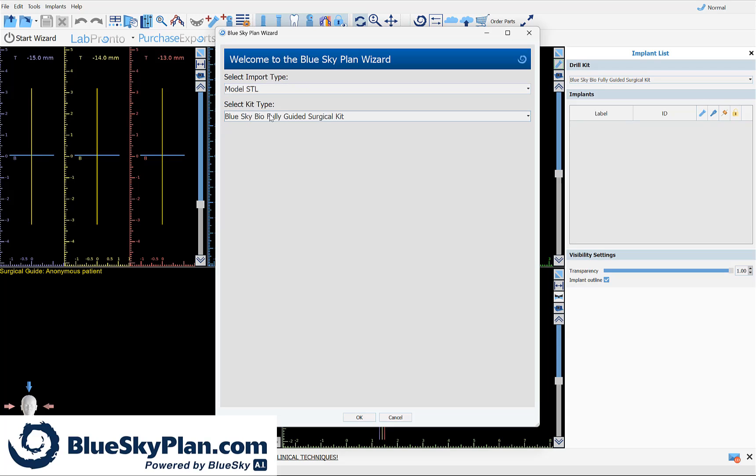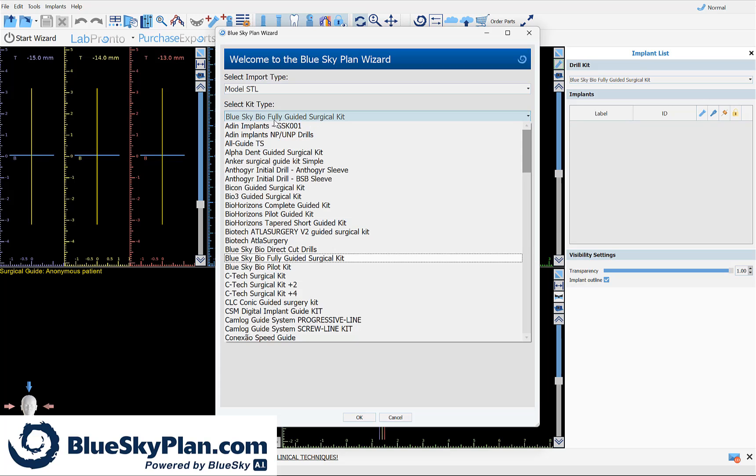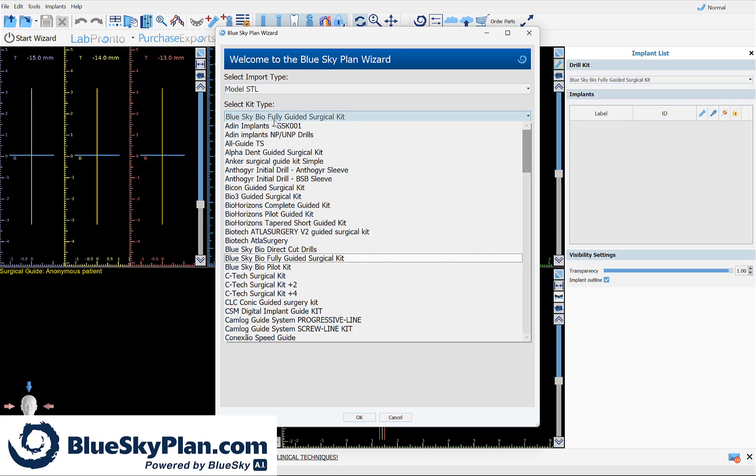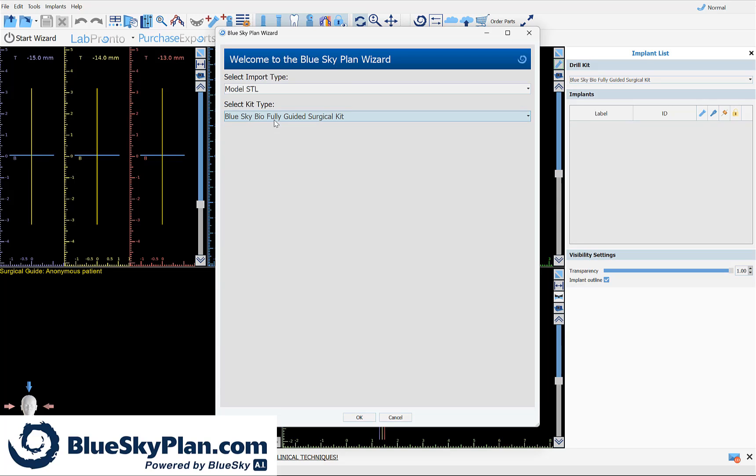Regarding the kit type, Blue Sky Plan now has around 70 different implant systems with a wide variety of surgical kit types. We, of course, recommend the use of the Blue Sky Bio Implant and the Blue Sky Bio fully guided surgical kit, but select the relevant kit and by doing so, Blue Sky Plan will do all the measurements and calculations for you.